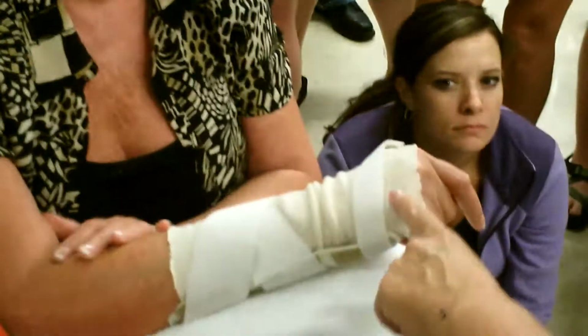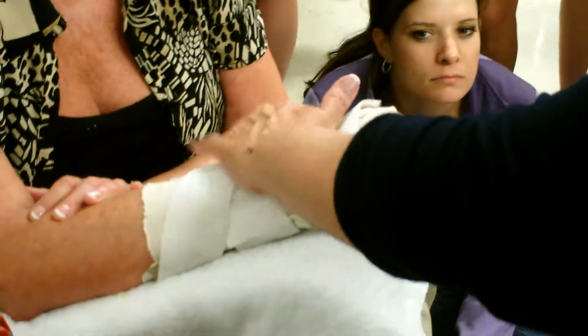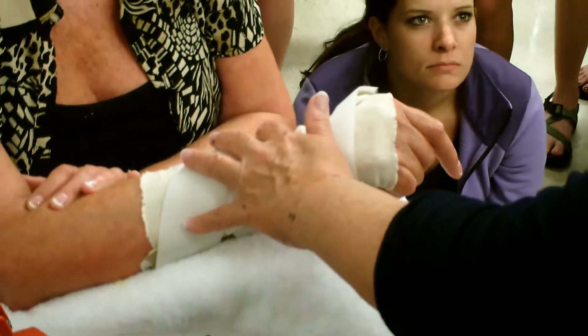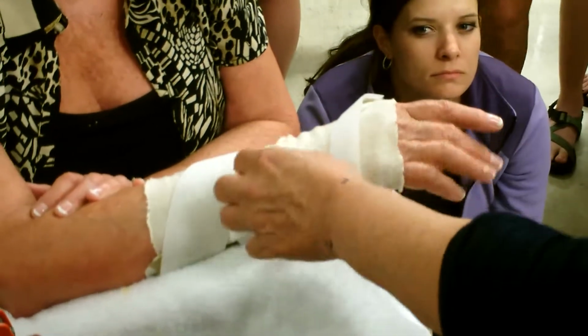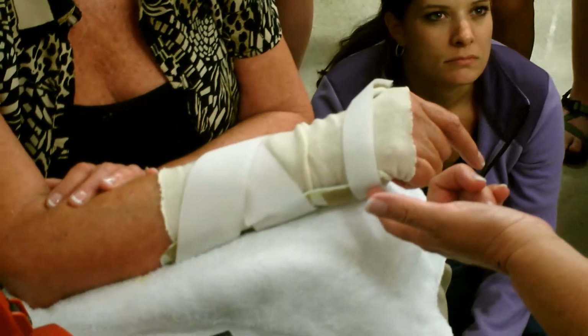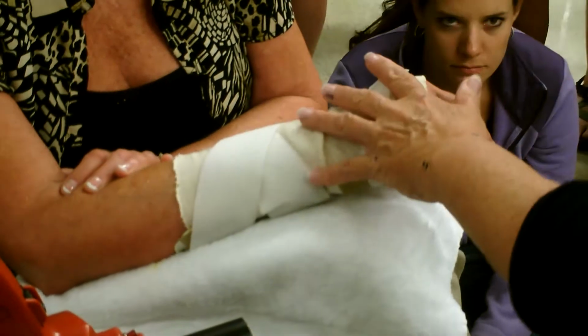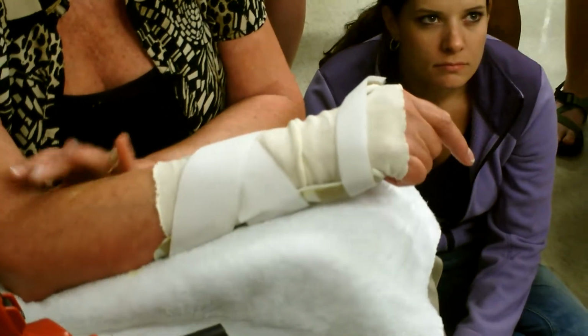I would do what you just did, Miss Rita, which is wear this sleeve under it, because this material tends to kind of make you sweat. So I would wear this under it, particularly in the summer. Do not leave this in your car because it'll melt in this hot summer. Take it off when you take a shower. And again, if there is any red areas, any discomfort, you feel like it's not doing what it needs to do, you call me back and you make an appointment and we'll readjust it.